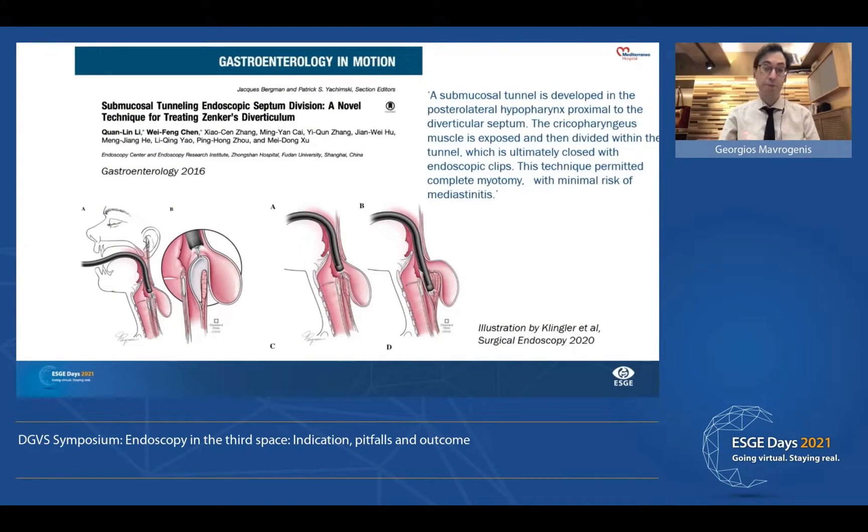In 2016, a new procedure was presented by a group from China. Dr. Lee and his colleagues presented an innovative procedure that was finally called ZPOEM. This procedure borrows the concepts of POEM. The endoscopist performs two tunnels along the two sides of the septum — the first tunnel along the esophageal side and the other along the diverticular side. Once the two tunnels are created, the septum is exposed and we can proceed to full thickness myotomy, which is the crucial part of this procedure. Once done, we close the entrance point with clips.